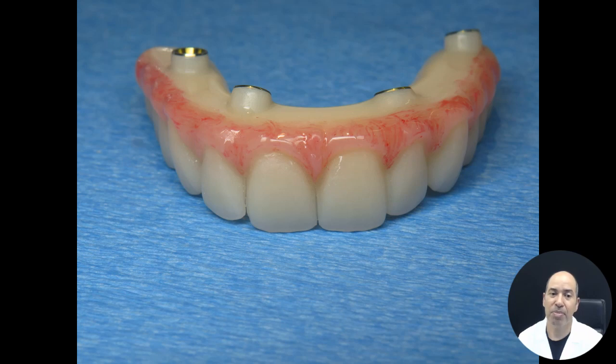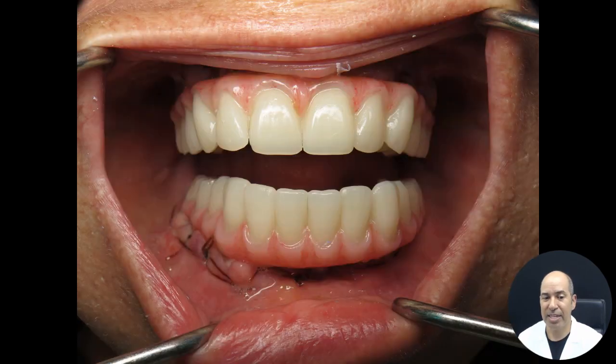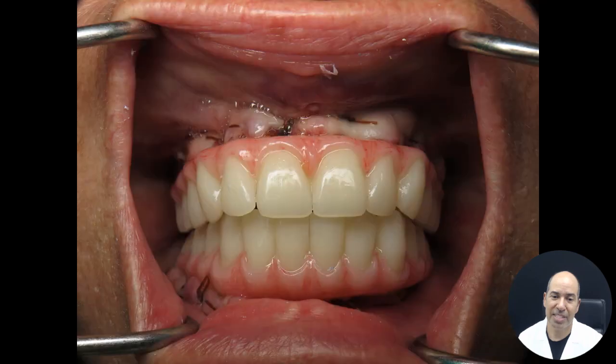But these are my prototypes. So they're designed to look really good. And this is what they look like outside of the mouth. This is the next day. You can still see the sutures there. This is what her teeth look like. This is when she bites down.